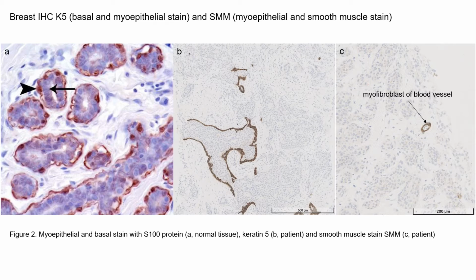On the patient sample, however, patchy immunoreactivity with keratin 5 antibody demonstrates a mixed cell population, epithelial hyperplasia, and absence of basal cells. Lack of complete membrane staining distinguishes this cancer from ductal carcinoma in situ, in which the duct membrane is intact and epithelial cells are not invading surrounding tissue.